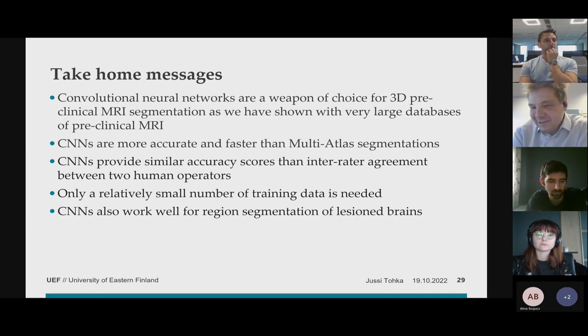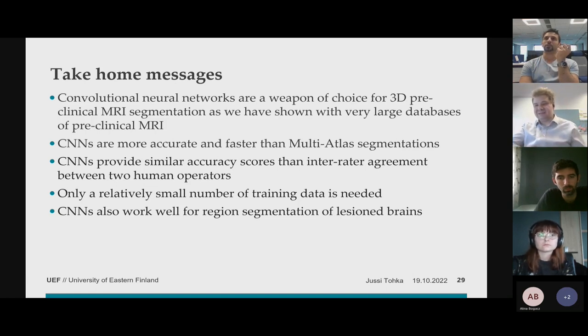And then also, for mice, you had the reason to, because there was not such an amount of atlases or segmentations. In humans, we have atlases. But why are we not also doing something like this if it's shown that it's better? What do you think? Because people are used to using atlases for humans? Yeah, probably. I think there are pretty good neural network-based segmentation algorithms in humans also, most notably in FreeSurfer. Now this year, uh-huh.